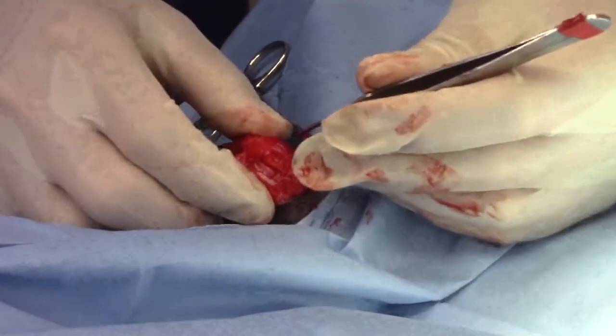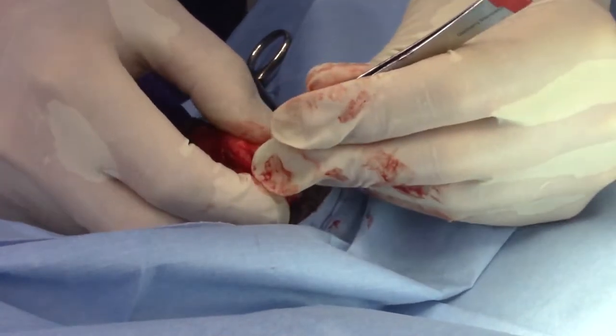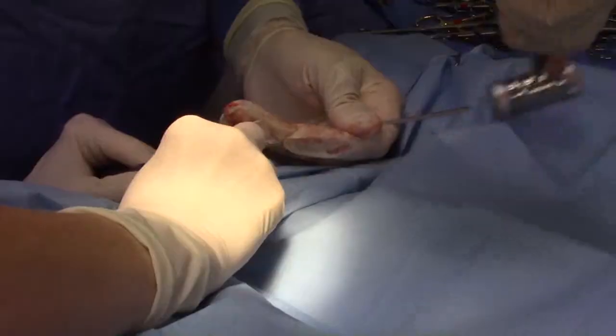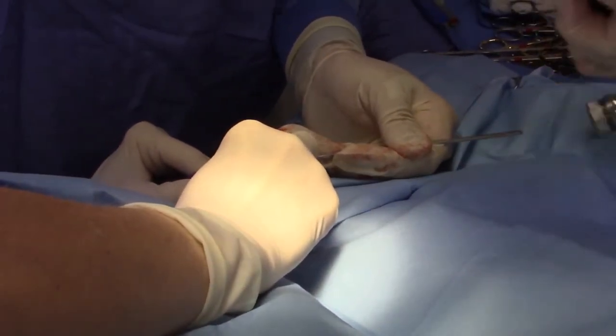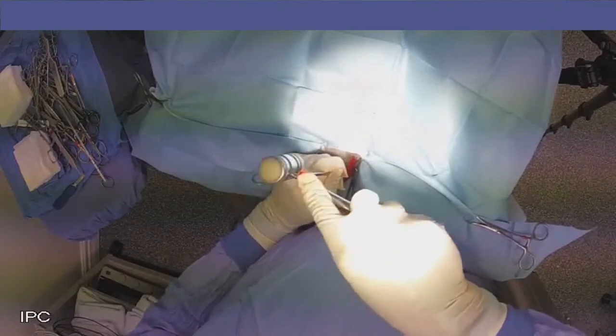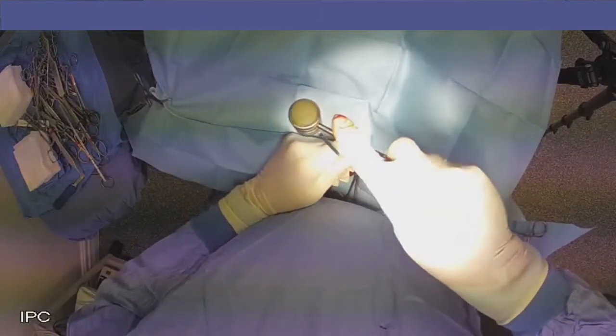Now that I have deepened the trochlear groove, I replace the trochlear block and am pulling the patella back in place where it's supposed to be. We don't need to do anything else to secure the trochlear block in place — that strong patella ligament will hold it in place until it heals.